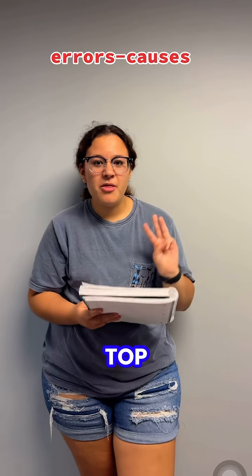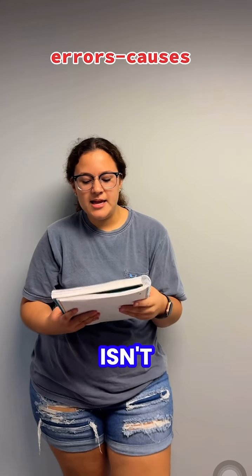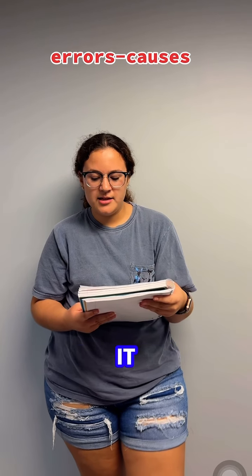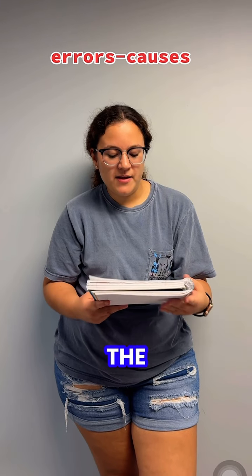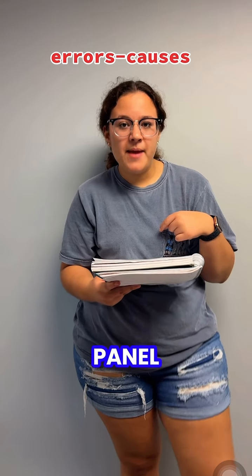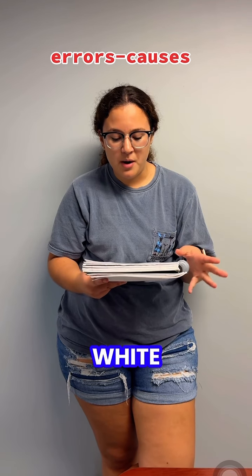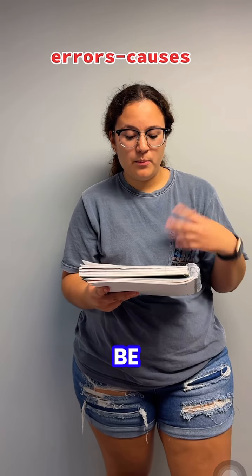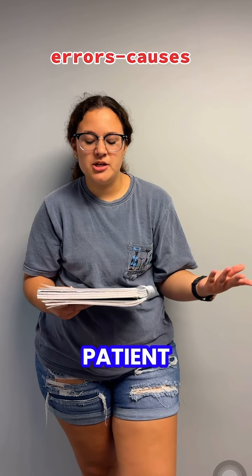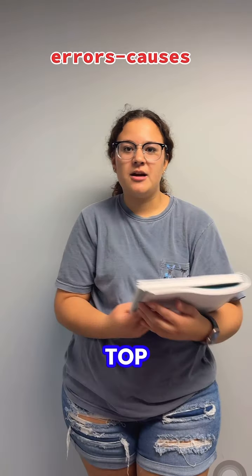So these are the top 3 errors and causes for those errors. If the tongue isn't on the roof of the mouth, it distorts and cuts off the apex of the anterior teeth. If the lead apron touches the back of the pano machine, it turns the image white. And then if the patient moves, it causes the picture to be blurry, and then we must instruct the patient to be still. There are a couple more, but those are just the top ones.